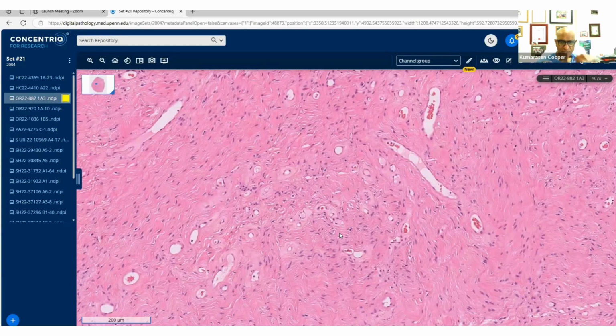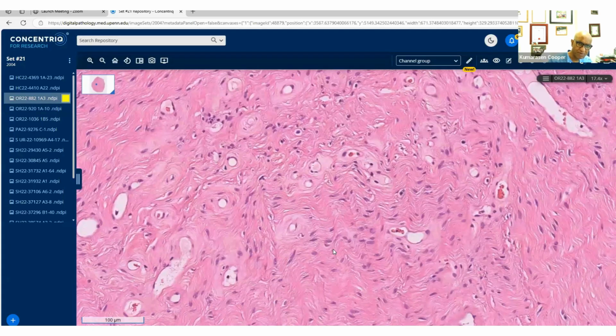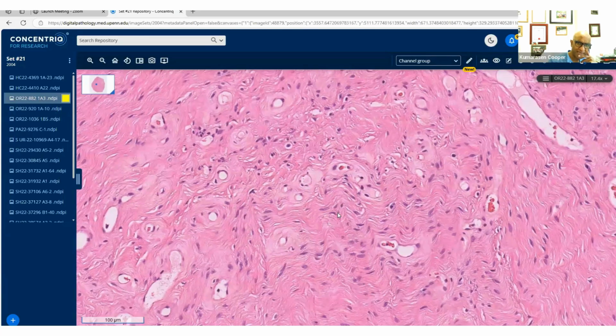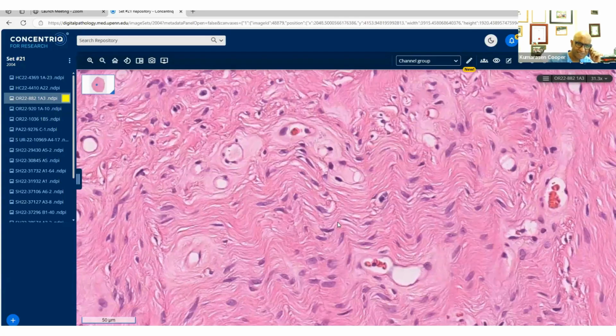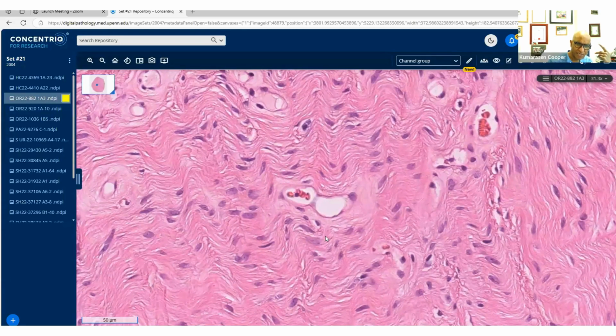Remember also that the myofibroblastomas follow the milk line. They were first described in the breast. And strictly those in the genital tract are known as extramammary myofibroblastomas. I don't necessarily use that term, but here I'm just showing you these high power hyalinized vasculature, just the small, tiny little vessels. They're beautifully hyalinized. So CD34 positive, ER positive, RB1 lost, because these have the 13q deletion for RB, which is lost.